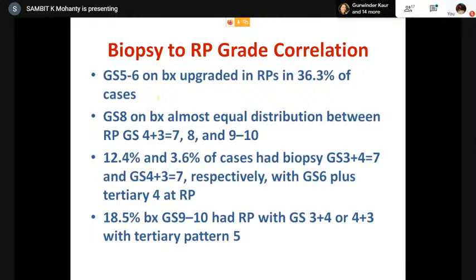This is something we need to know. You have a biopsy report. After a couple of weeks or next week, you get a radical prostatectomy. Another thing: in a prostatic needle core biopsy, if we see seminal vesicle wall infiltrated by the tumor, or extraprostatic fat with tumor invasion, please mention that, because that is called extraprostatic extension. When there is extraprostatic extension, the tumor is outside the premises of the gland. The patient is not a candidate for radical prostatectomy. You cannot do radical prostatectomy in that case. So they are dependent on androgen deprivation therapy.